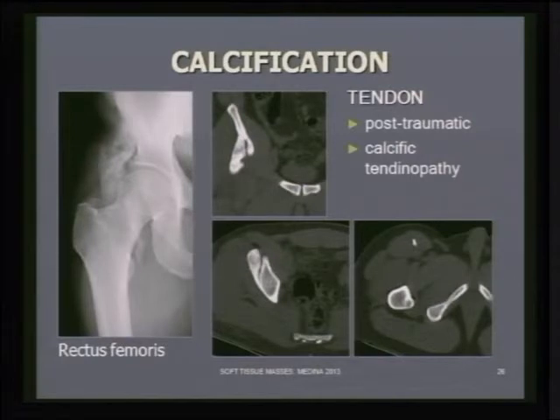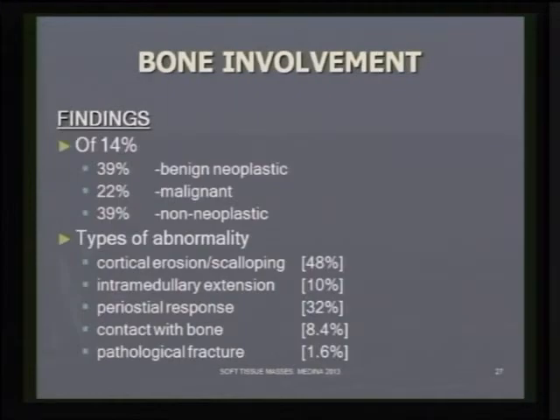And this is confirmed on the CT study here, where we can see that it's arising from the reflected head of rectus femoris here, just superolateral to the acetabulum on the coronal and axial images. And we can continue and follow the ossification down into the tendon of the rectus femoris. So the diagnosis here is really made by looking at its anatomical location of the ossification and the calcification and locating it to the site of a known major tendon.